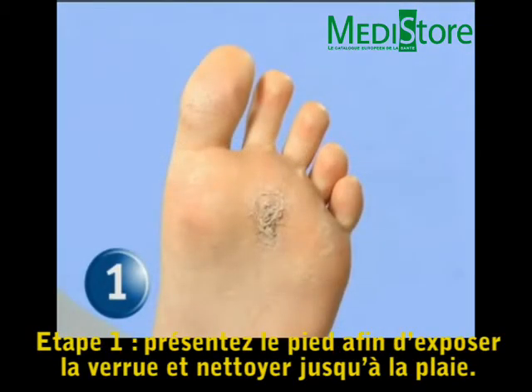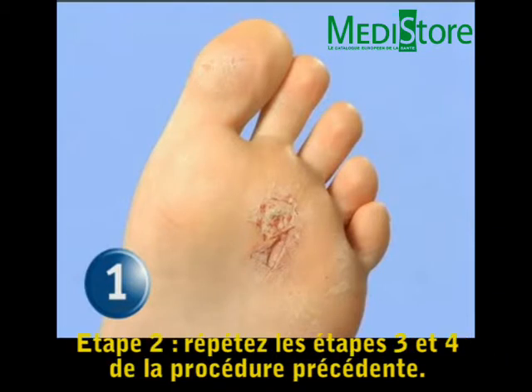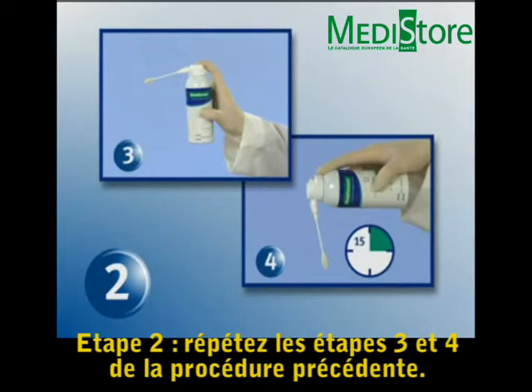Step 1: Position the foot to debride the wart area to pinpoint bleeding prior to applying treatment. Hint: Use a hemostatic solution to stop the bleeding. Step 2: Repeat steps 3 and 4 of the basic HistoFreezer operation procedure.